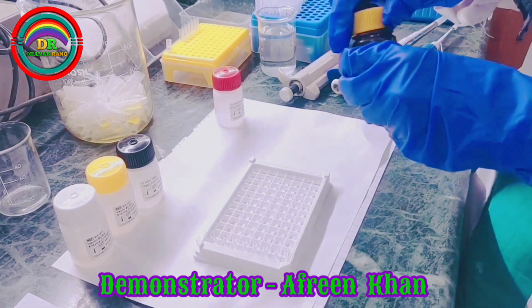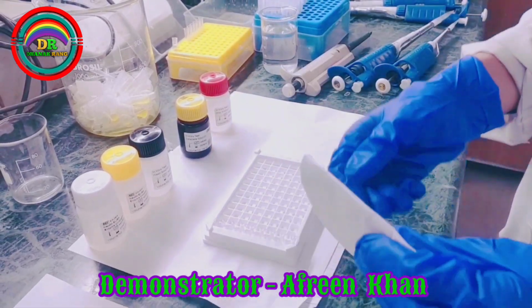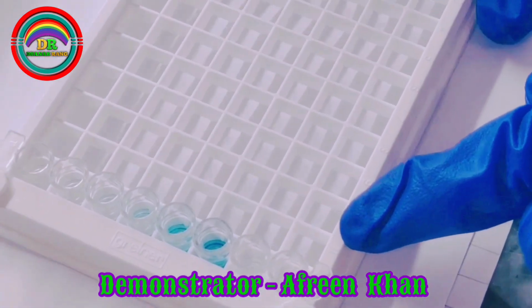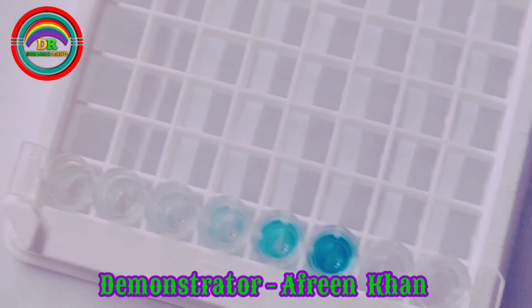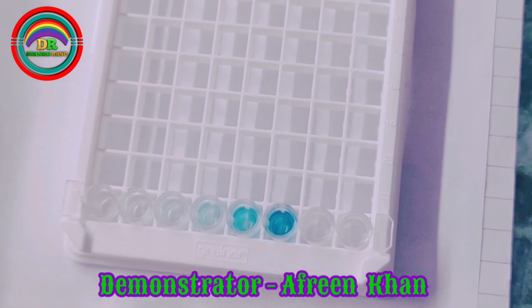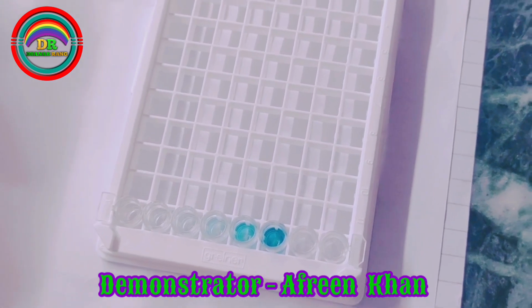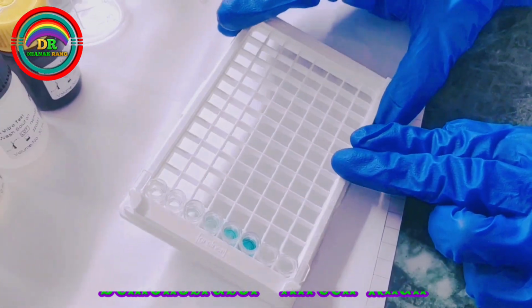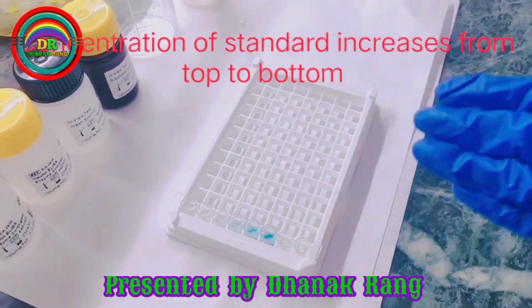Now we cover this plate and incubate it for 15 minutes for the color to generate. We have incubated it for 15 minutes and you can see the color has developed. The color is directly proportional to the concentration of insulin. So we have taken 6 standards. From standard 1 to 6 the concentration is increasing. So we can see the color is also getting darker from top to bottom.